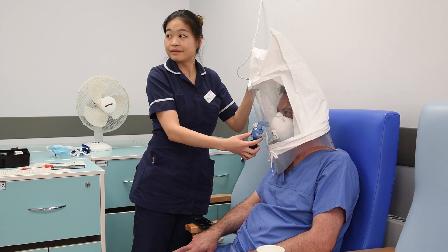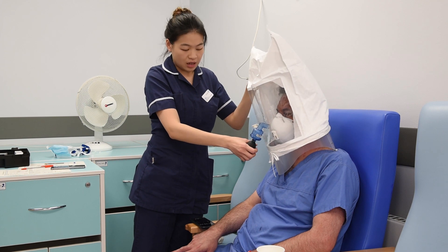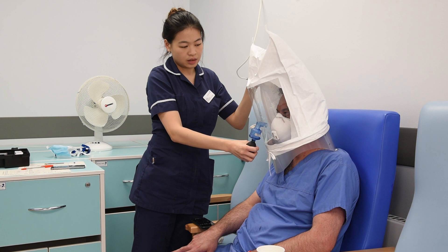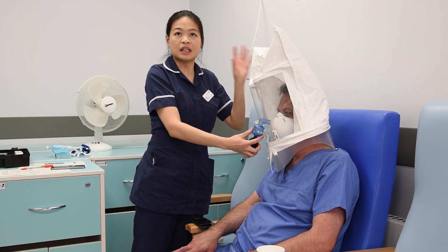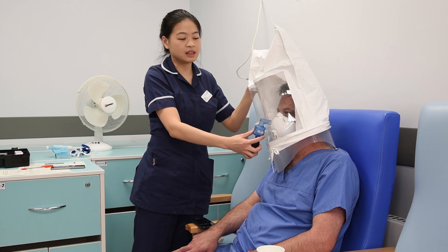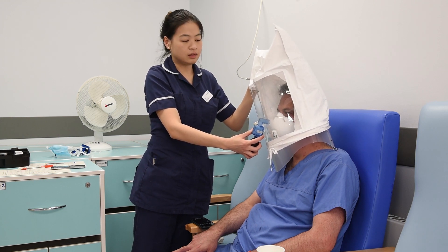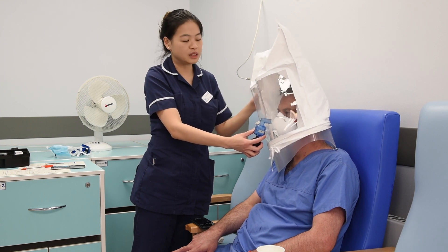We're breathing through the mouth — normal breathing, nose over. All these exercises will basically pass what the little things you do every day without realising: like turning your head, talking, breathing, and specific movements as well.